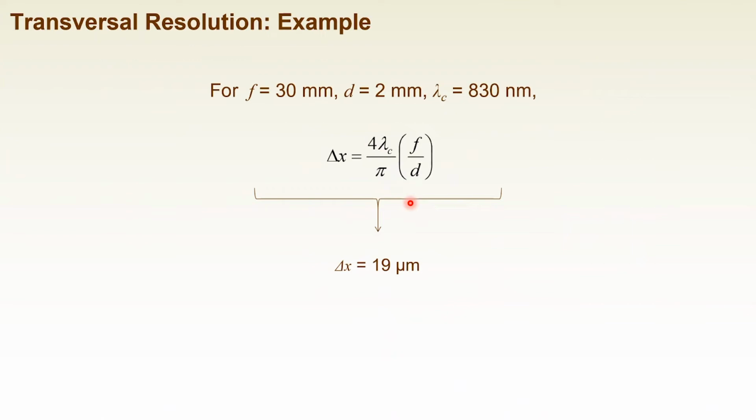And recently, we have a high resolution OCT, the so-called OCT microscope. But even in this case, in most cases the resolution is something like 3 to 5 microns. It's still worse than a standard microscopy. Please keep this point in your mind. OCT in general has a lower resolution than a standard microscope. I'm not going to get into details in this lecture, but alternatively, OCT has a high imaging depth penetration. It's a kind of trade-off. To overcome it, there are several techniques like extended focus, an optical trick, and also computational refocusing. But it's a slightly different story. It's out of scope of this lecture.